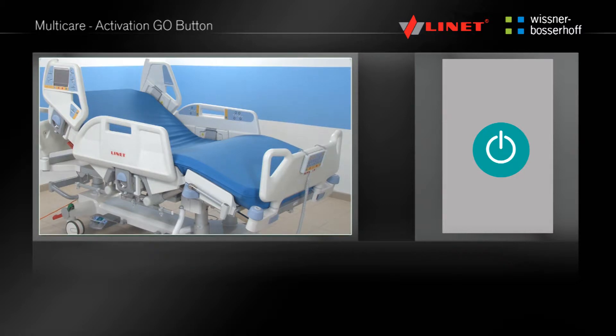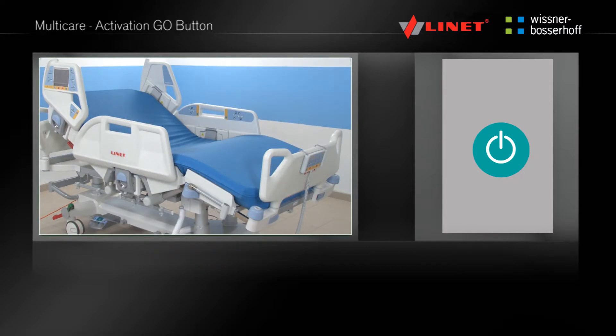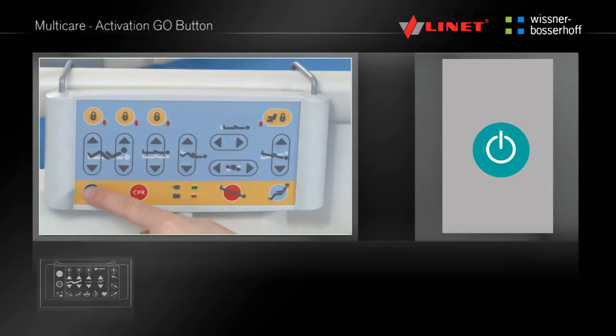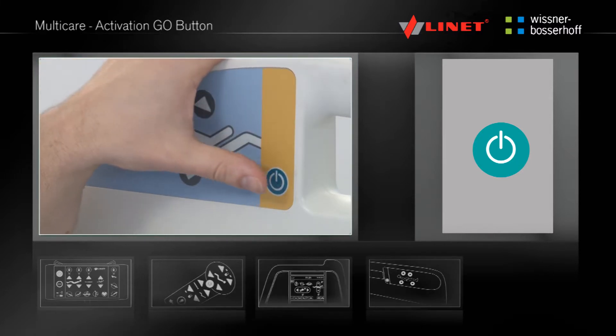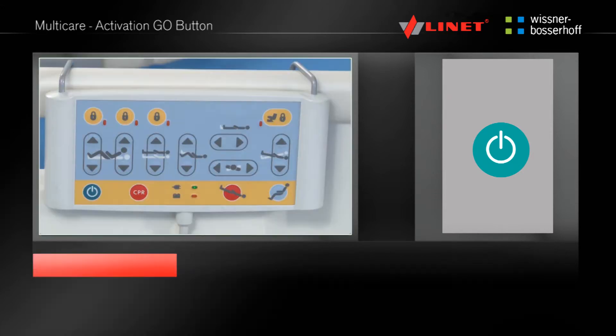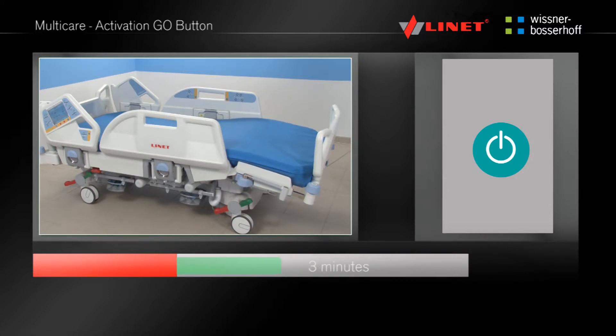The electrical functions of the bed are locked for safety reasons. This feature prevents the unintentional positioning of the bed if one of the buttons were pressed accidentally. The electrical functions can be activated by pressing the Go button, which is located on the Supervisor panel, the handset and the integrated side rail controls. The electrical functions of the bed are activated for a period of three minutes by pressing the Go button. During this period, there is no need to press the Go button again. The time period is automatically prolonged by pressing any other function button.